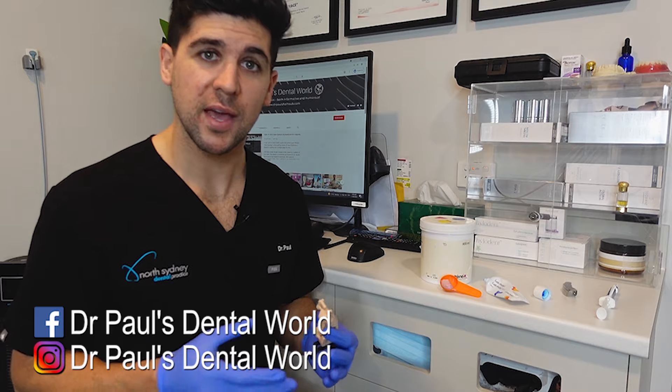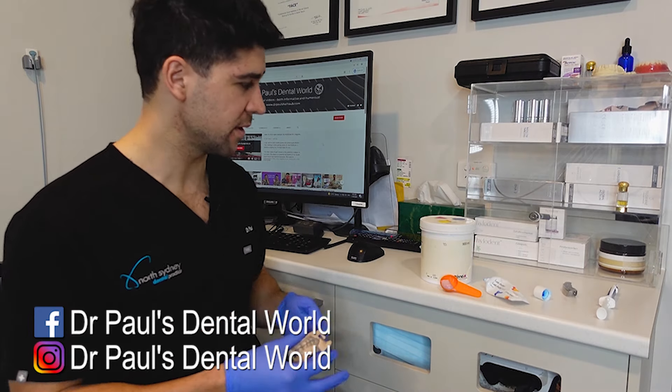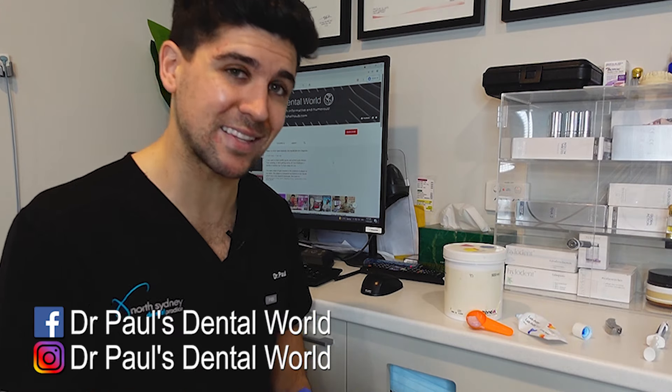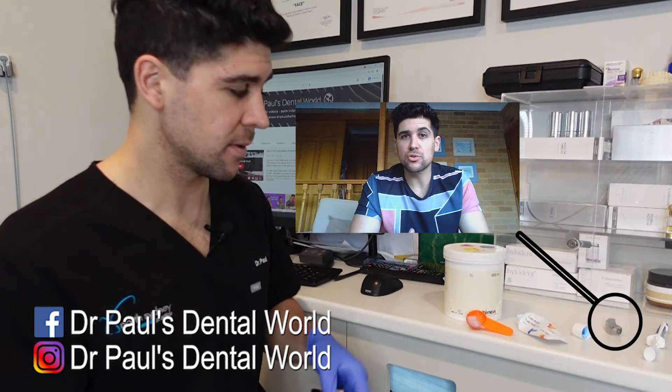So for this video, I'm gonna show you how to do it out of the mouth, then I'm gonna show you on an actual patient. First thing that we need to do is to take an actual index. Now what I do that with is a putty. The reason that I use a putty is that it becomes really, really firm, and the more firm the material is that you take the index with, the better fitting the crown's going to be. I also use a metal tray to hold the putty in place, for the same reason — more firmness and rigidity means it's gonna be more accurate.